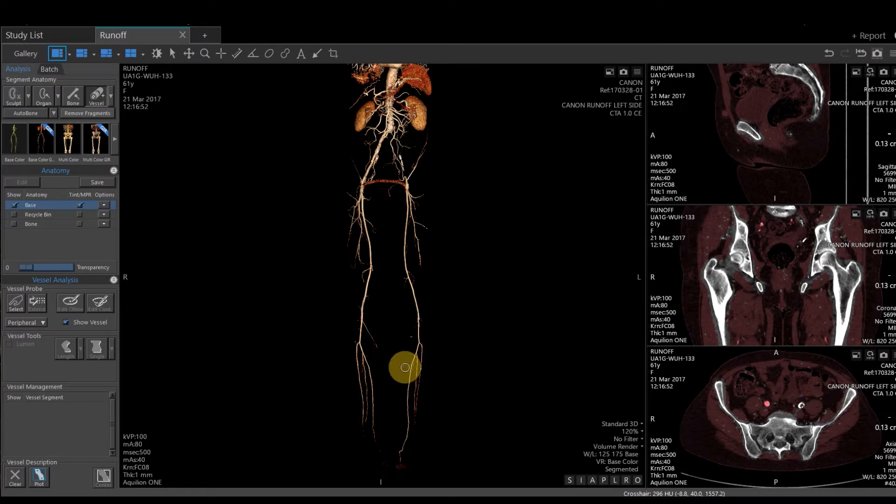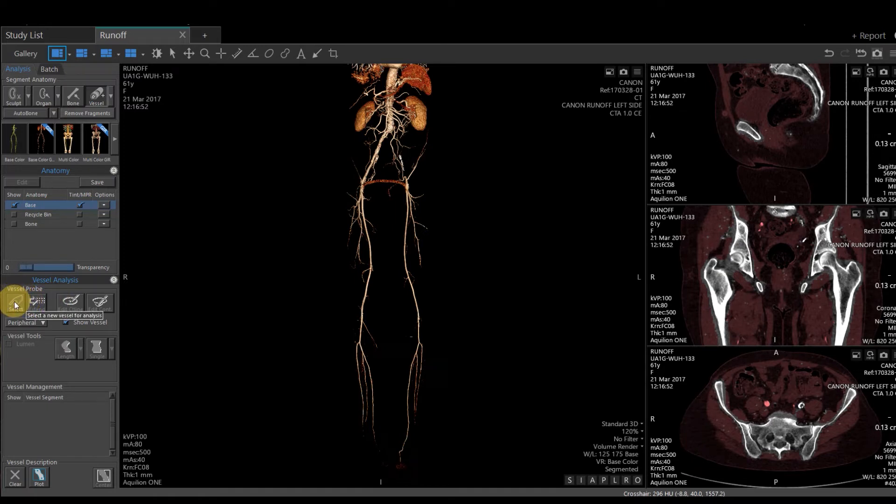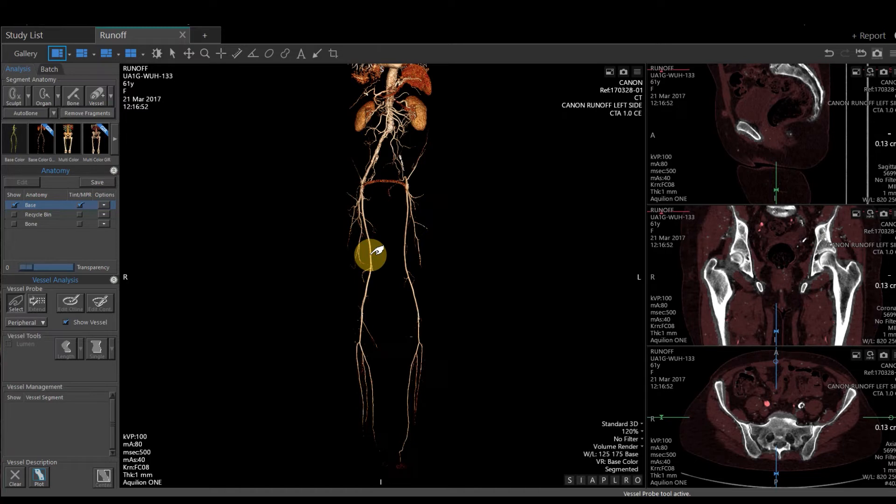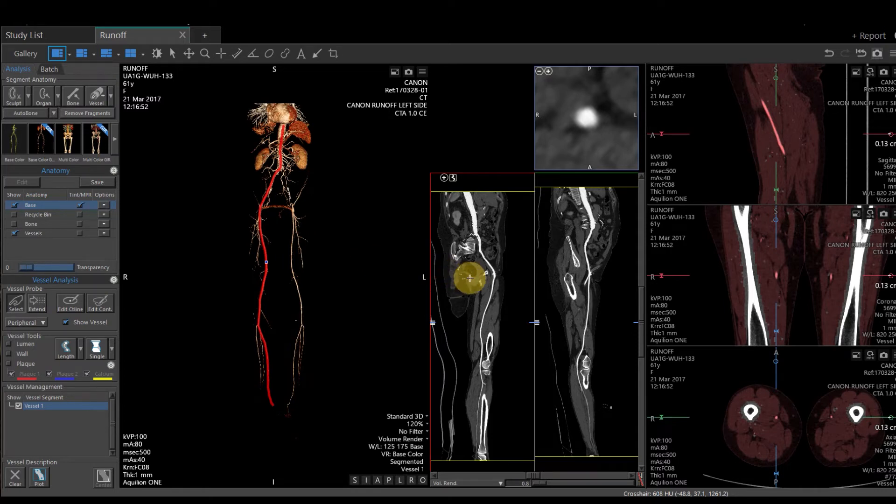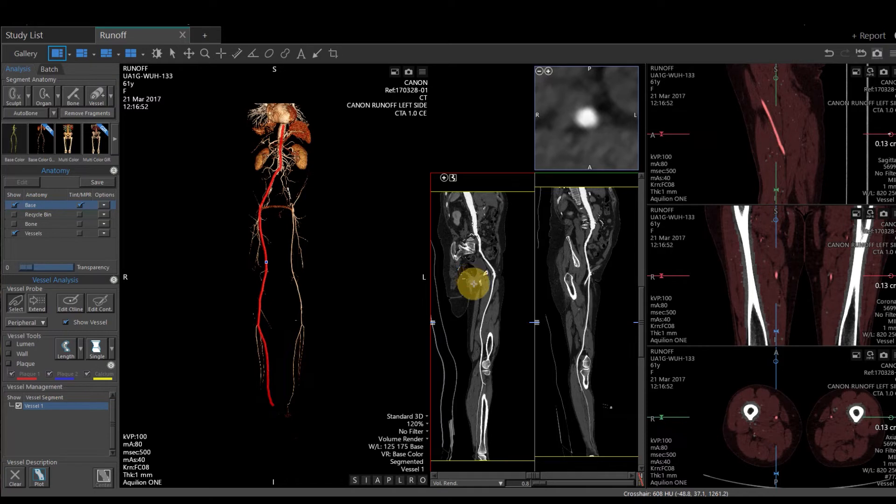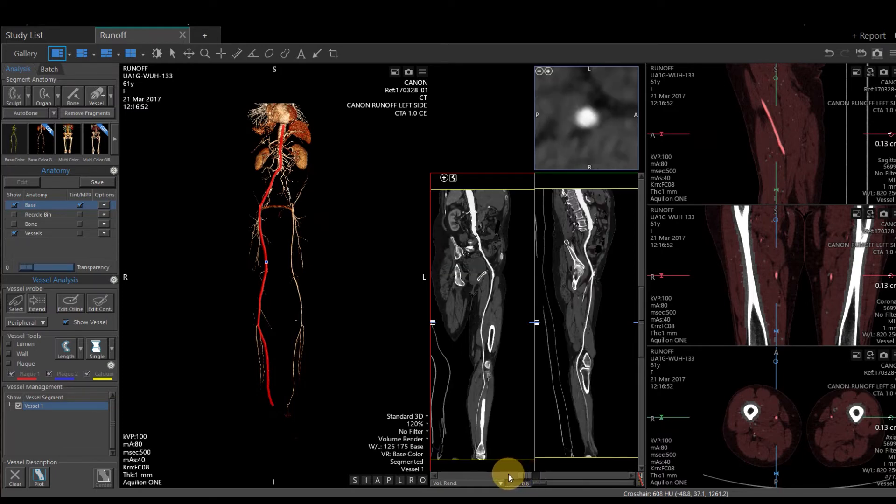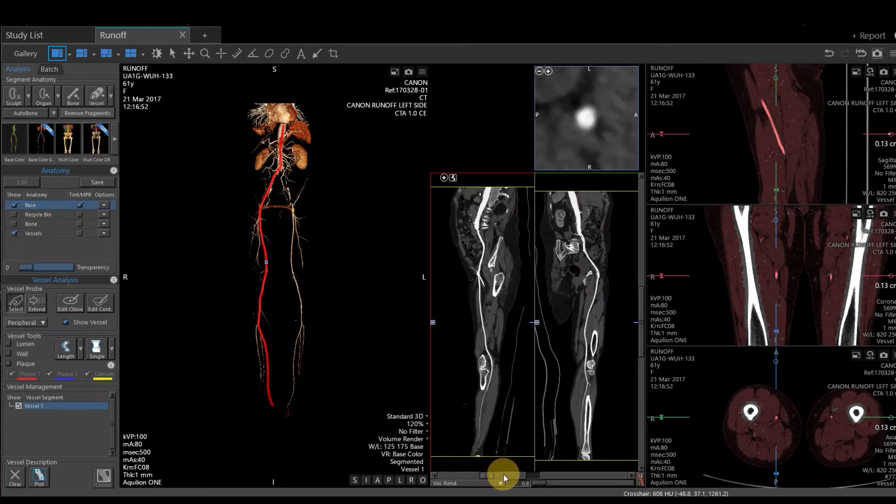The next thing I want to do is a vessel analysis. Halfway down the screen on the left-hand side, we have a vessel probe option and a select button directly under that. If I want to look at this leg vessel, I'm going to single left click on that vessel. Vitrea is going to go through and draw a center line as far up and as far down as it can. It's going to create a curved planar format. This is a split vessel view. It's going to have 90 degree apart images. Directly below, you have a slide bar. To rotate around, you just left click and drag this bar and it rotates around that entire vessel.